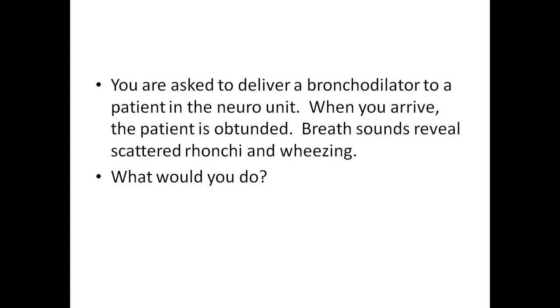Well, first it's important to know what obtunded means. That means they're not responding to stimuli. So we can't give verbal orders. They're not alert and cooperative. In this case, if we have wheezing and we need to give a bronchodilator therapy or aerosol medication, delivery suggestion would probably be to use a small volume nebulizer.